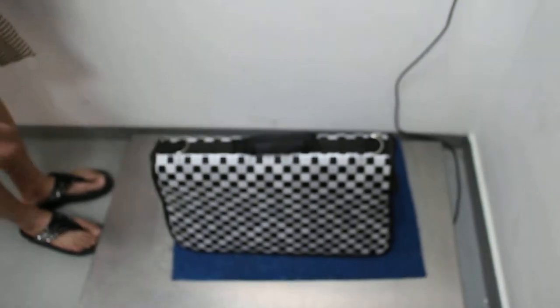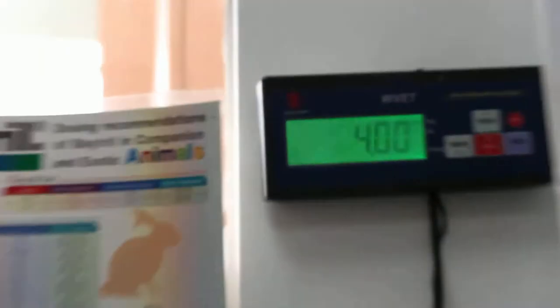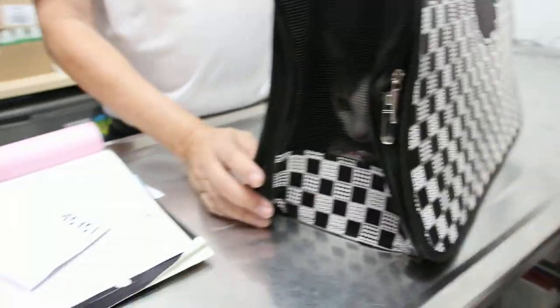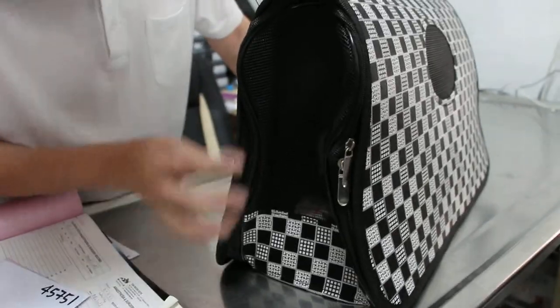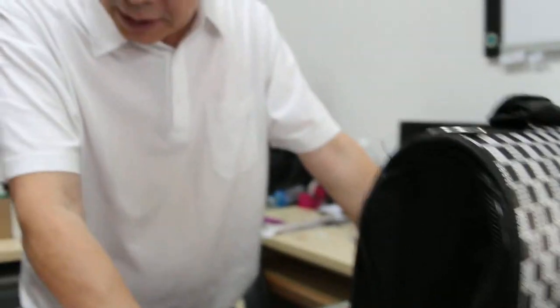But of course, the best is to weigh the cat with the carrier. According to the machine, it's 4kg. Then we take the carrier out and subtract the weight of the carrier. According to the owner, it's 500 grams, so the cat will be 3.5kg.